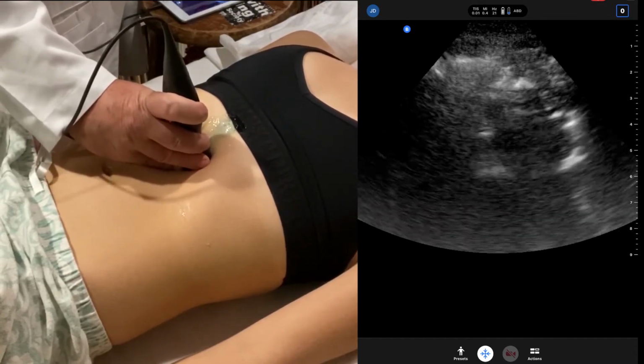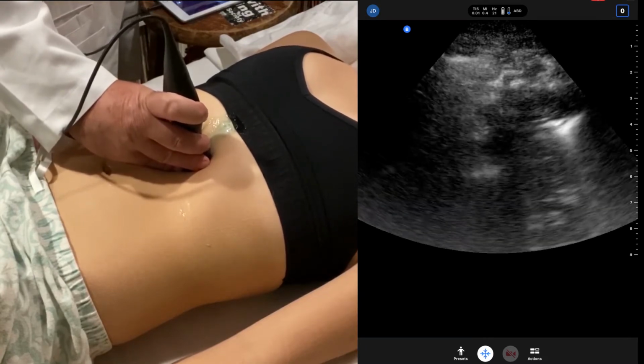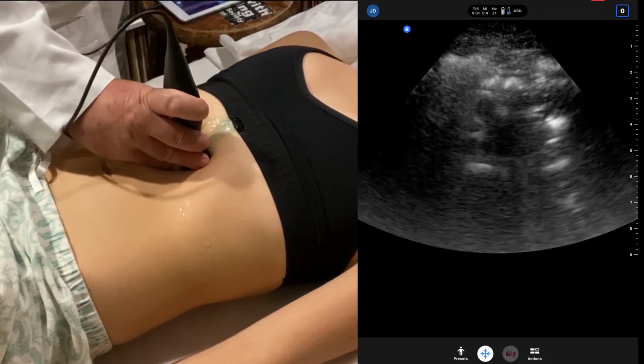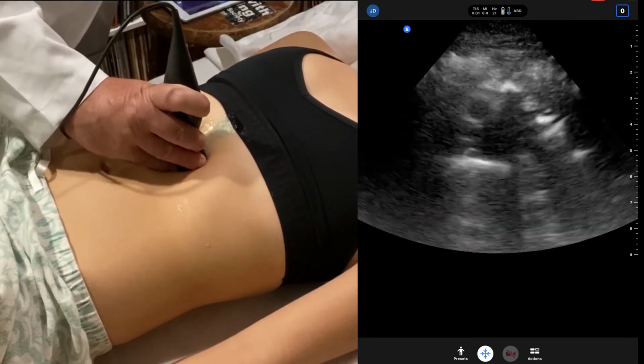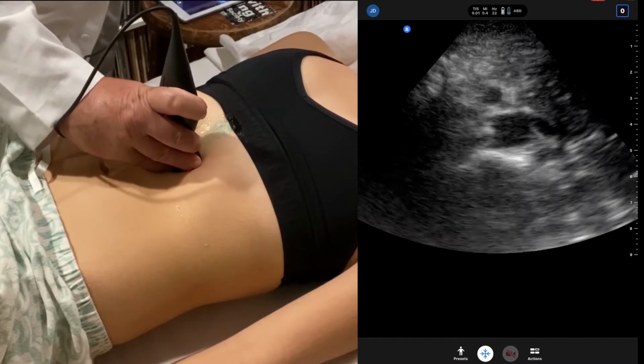And our first stop along the way is to scan to find the celiac artery, the celiac trunk, which will split towards the spleen, to the splenic artery, then to the left as the hepatic artery. This is also known as the seagull sign. So what we're going to do here is attempt to find, this at times can be a tough view initially, the first stop on our trolley line through the aorta.